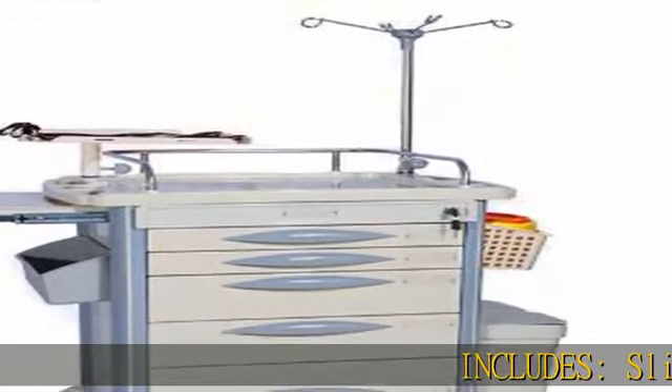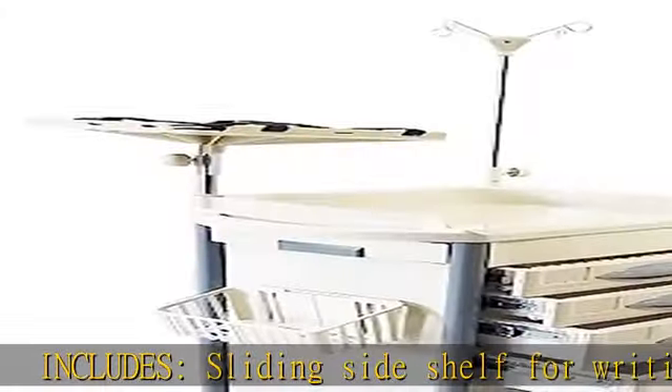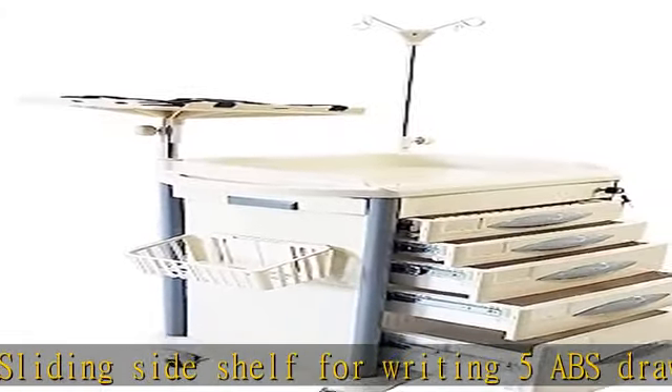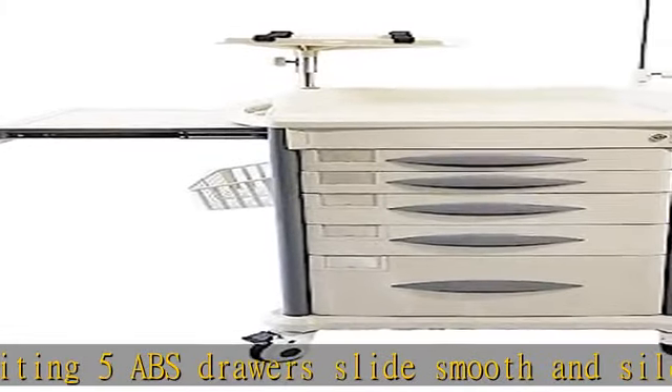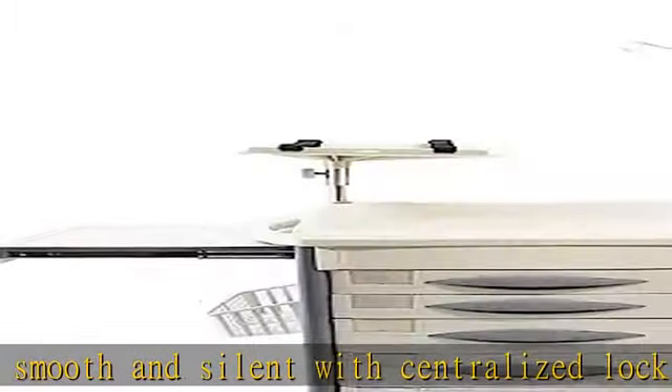Includes: sliding side shelf for writing, 5 ABS drawers that slide smooth and silent with centralized lock and plug-in labels to avoid dust, 3 flexible material storage bins that can be used for gloves, etc., and 4 anti-static casters.